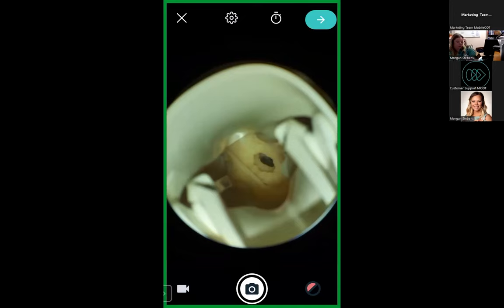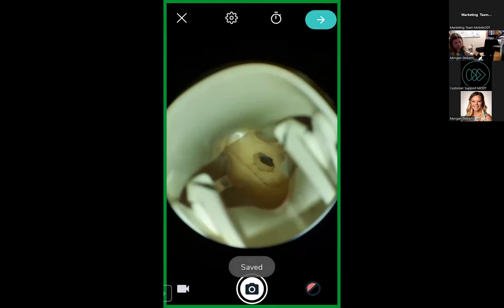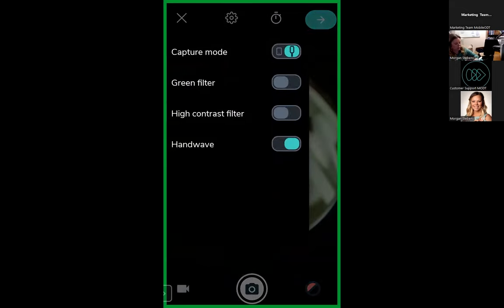So like if I touch it, it moves a little bit. So, I don't want to move it at all. I'm just going to use the hand wave motion. And of course, whenever I don't want it to do it all the time, it does it. So let's go back and turn off that hand wave motion.